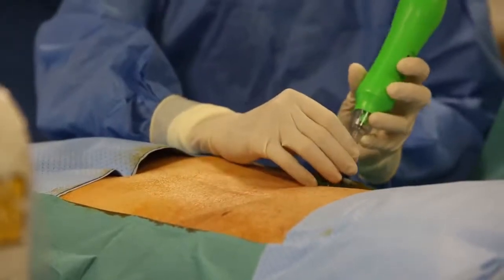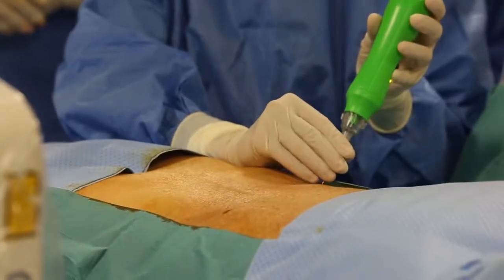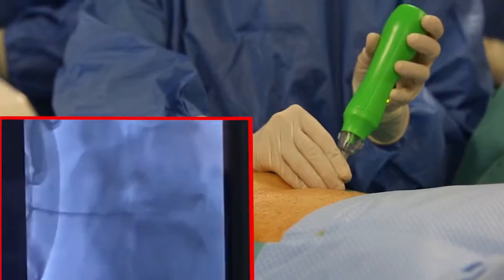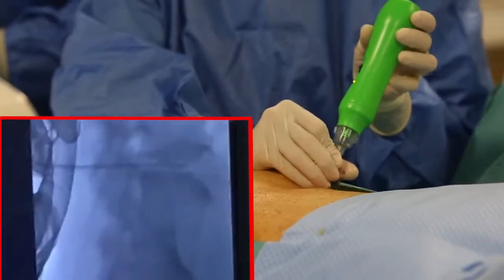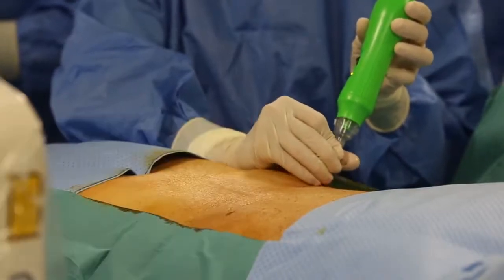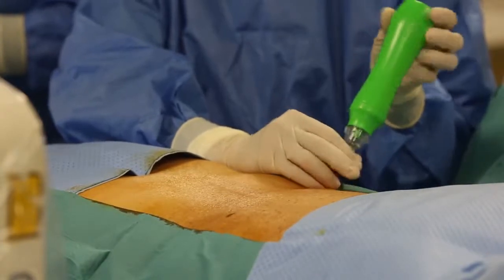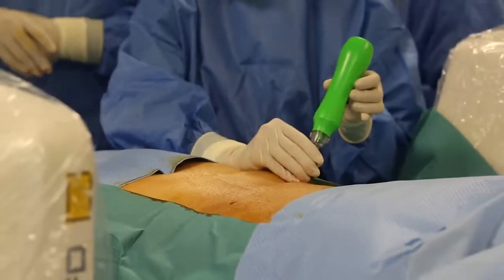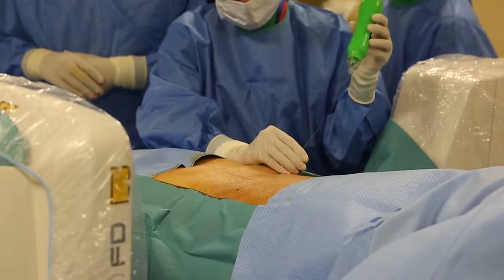We now proceed with the decompression of the disc by inserting the DISKOM device into the cannula. Once the device has been enabled using the ON button, alternate continuous antero-posterior movements with circular movements. After about 3 minutes, switch off and extract the device, needle and probe cannula included.